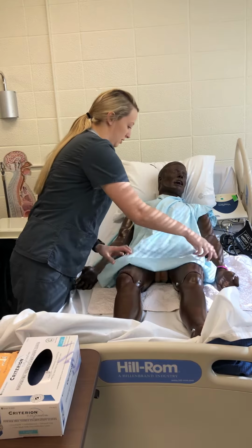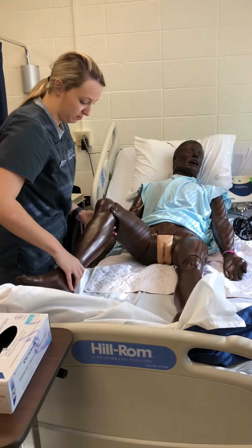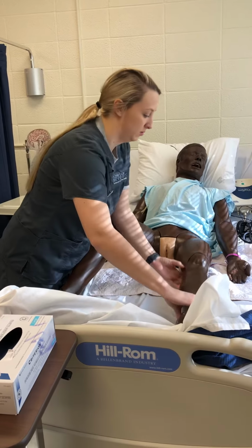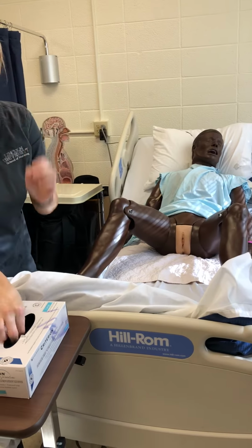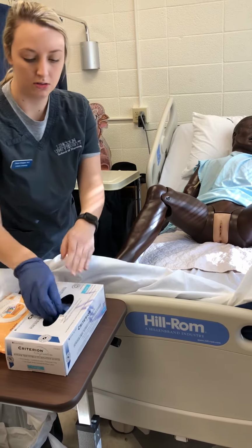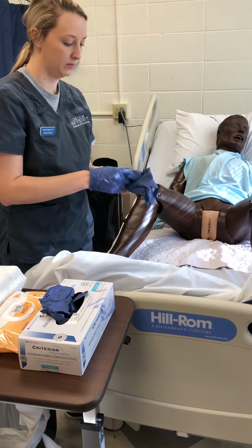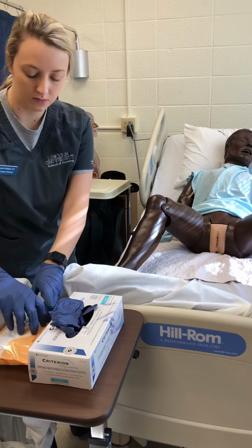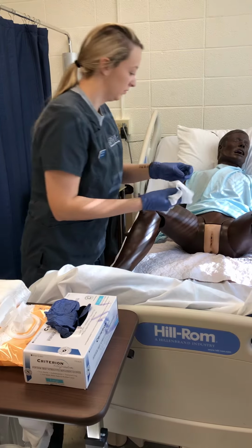Okay, I'm just going to lift your gown up. I'm going to put your legs in that position I told you about. Okay. First, I'm just going to clean off your area before I insert it. Cold wipe.